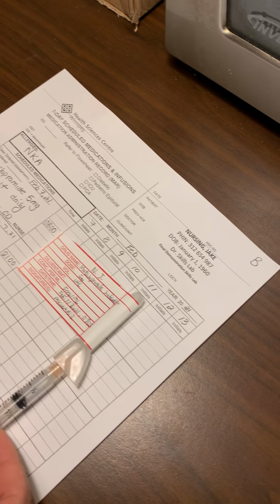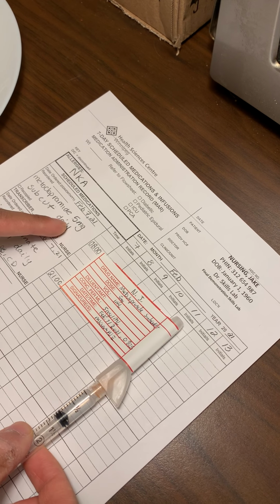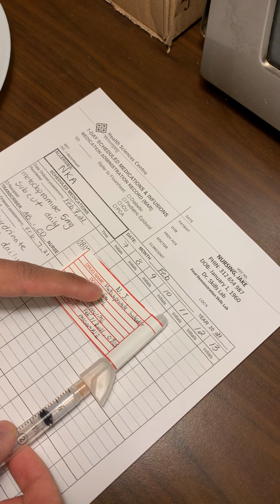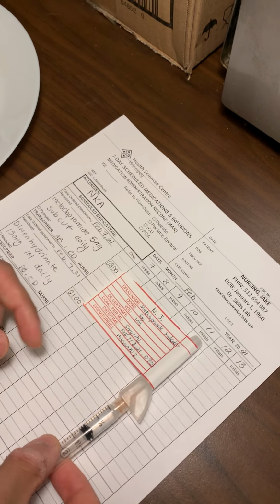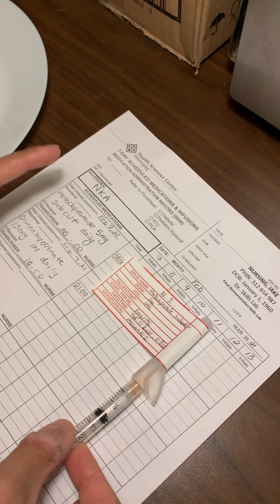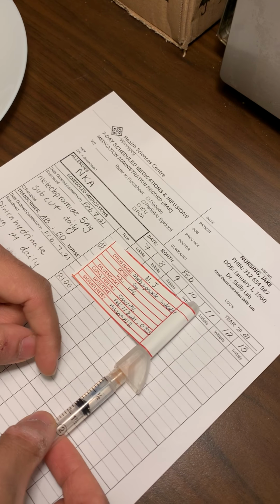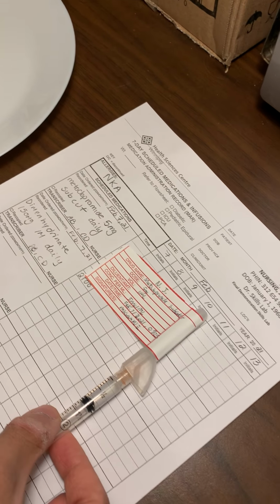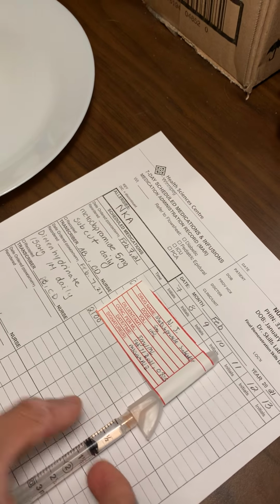This is for nursing Jake, and the medication name is metoclopramide, and this is metoclopramide, and the dose is 5 milligrams. The vial did come in 5 milligrams per ml, 10 milligrams per 2 ml, which is why I have 1 ml in this syringe, and the route is subcutaneous. This is a subcutaneous syringe and needle, and the vial was IM/IV, but I did get clarification from the pharmacy and the parenteral drug monograph that I can administer this subcutaneously.